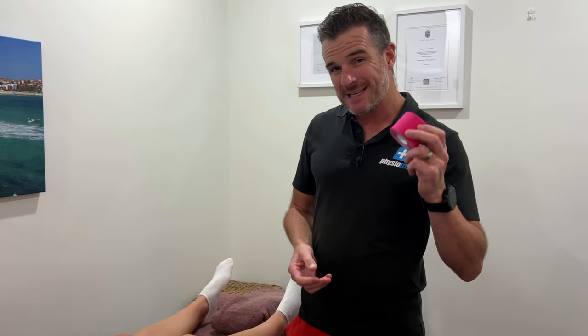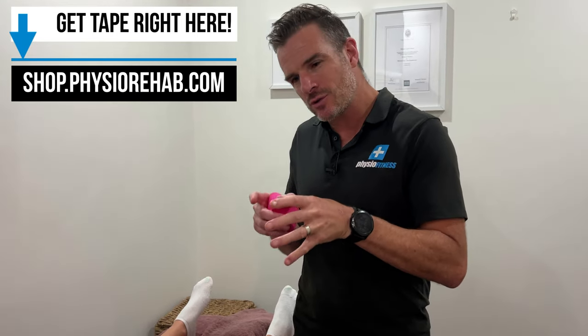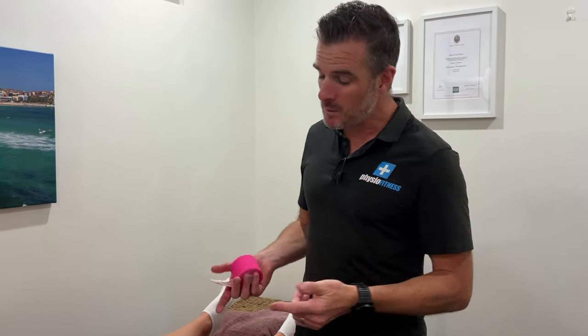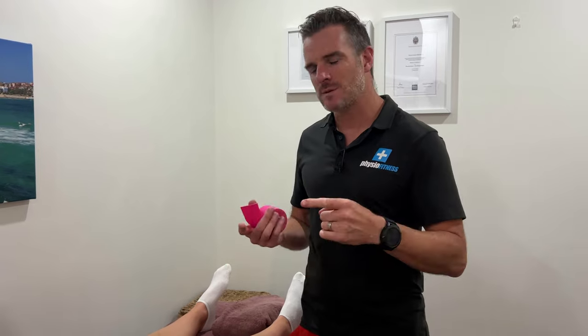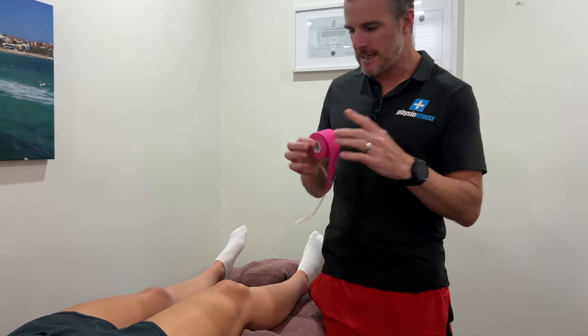We're going to use kinesio taping today because we are doing tendon and muscular taping, not ligament stabilizing joint taping. If we were stabilizing a joint, we'd be using rigid taping which doesn't stretch because we want to lock down a joint. We're not doing that — we want this knee to move. We're just trying to offload it and reduce the load through the tendons so you can handle some strengthening. So elastic, stretchy kinesio taping or K-tape is the go.